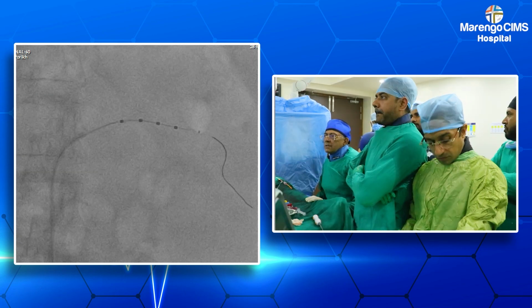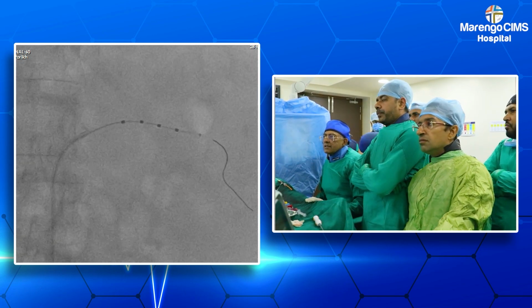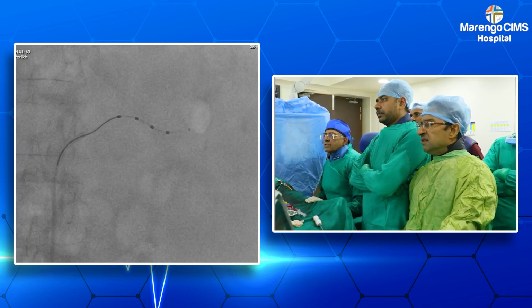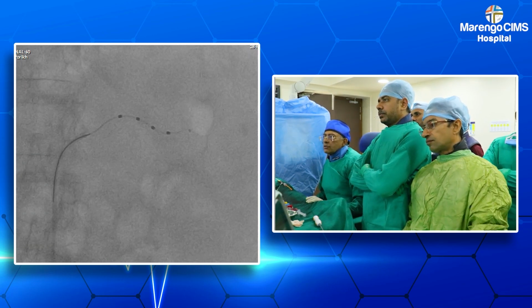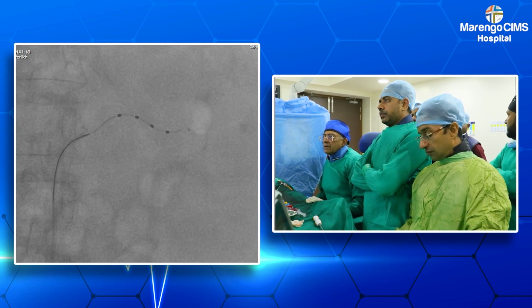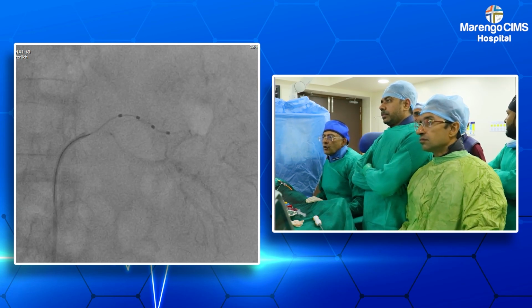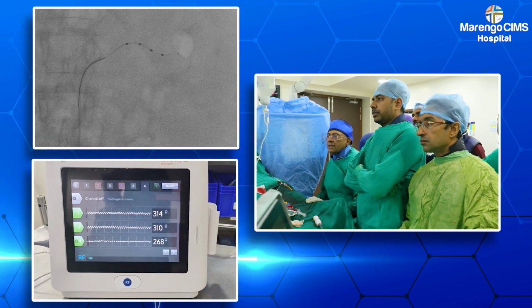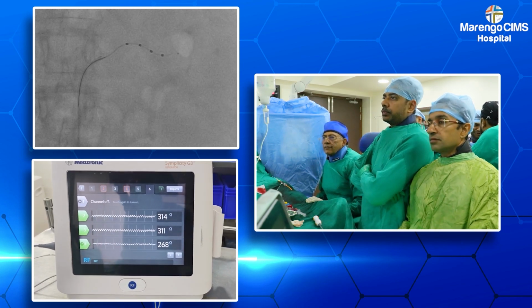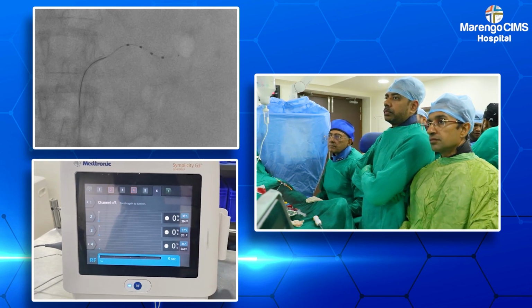on the left side. The distal electrode is in the overlap area where we had ablated earlier with the proximal most electrode earlier. So now the distal electrode will be shut off and we will activate the second, third and fourth electrode, right? Right. So I'm going ahead. Yes. So we have a good impedance. Channel 1 is off and we'll start the burn.